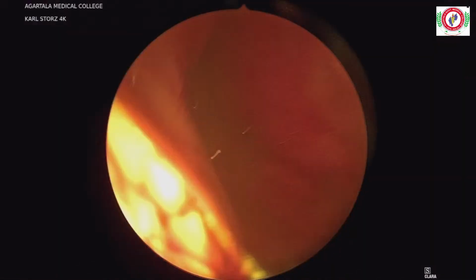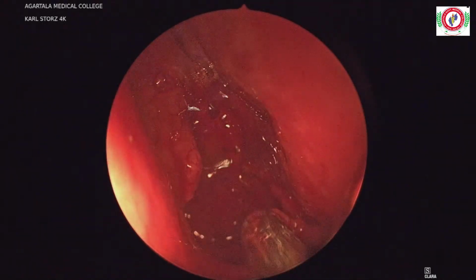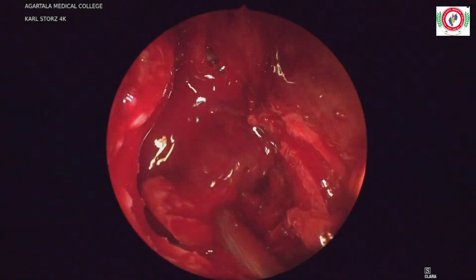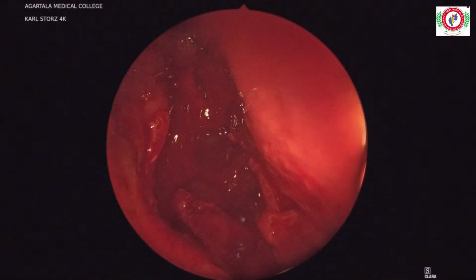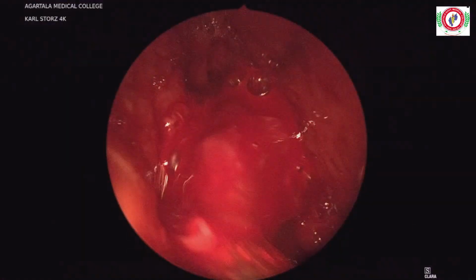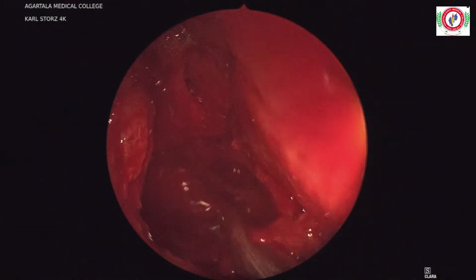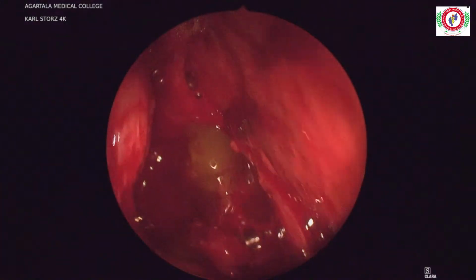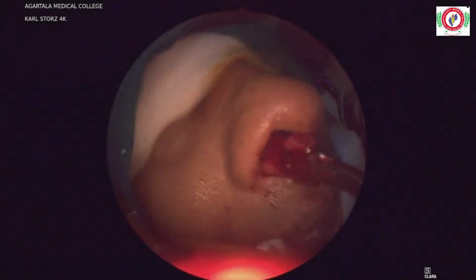Give me a big suction, straight and thick. Yes. Okay, so give me one wash. Wait, let me remove this first, and I'll give me Lux.